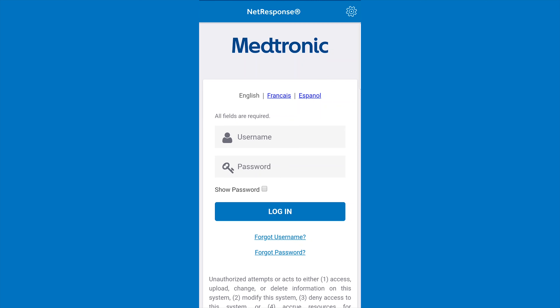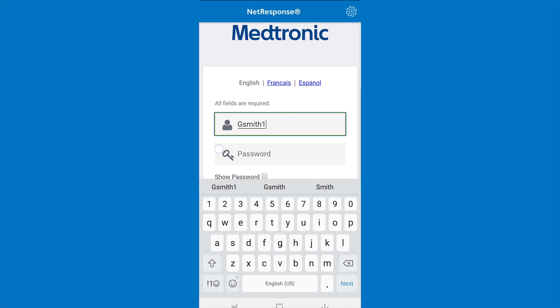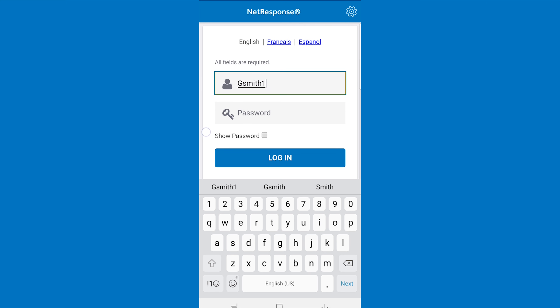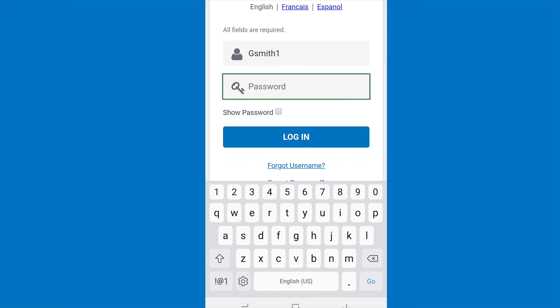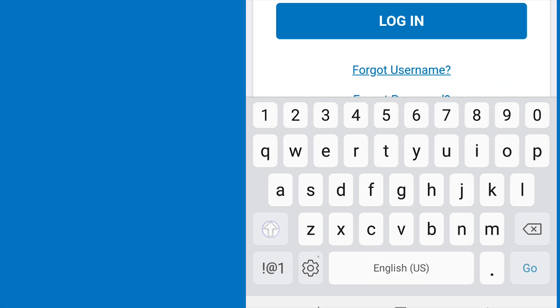The application will prompt you to enter your username and password. Enter the username and password exactly as they were given to you. The password is case sensitive. In my case, my username is Gsmith1 and my password is Medtronic123 with a capital M and an exclamation mark. I type in Gsmith1 on the keyboard. Next, to enter the capital M, I tap on the upward arrow, press on M, then enter the rest of the letters and numbers.